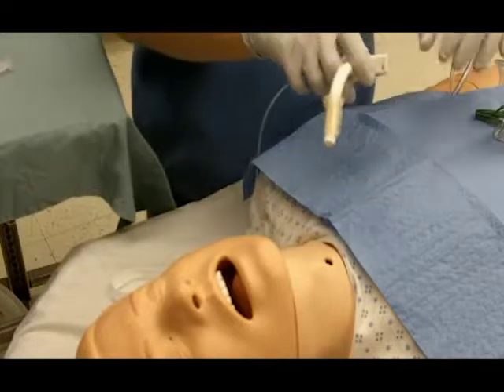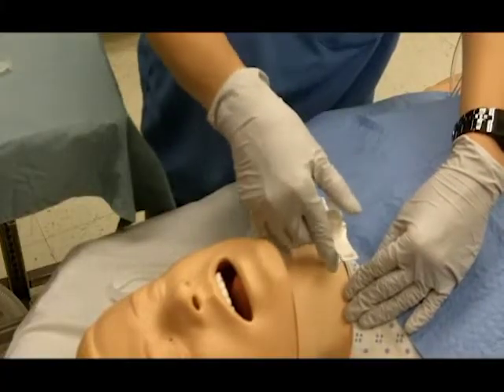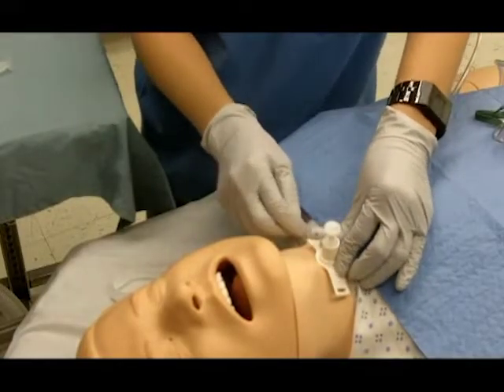Insert the new tube into the stoma along its curve in the same sweeping motion. Do not force the tracheostomy tube if you meet resistance, as this could create a false track. If you continue to have difficulty, use a smaller tracheostomy tube.